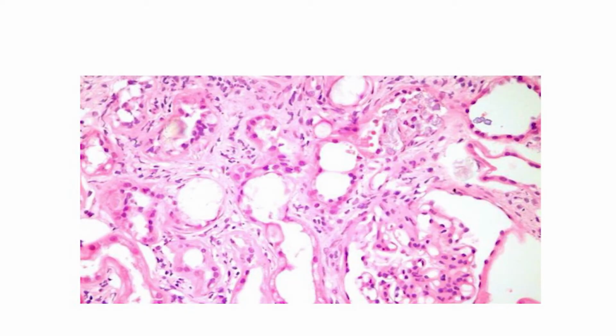In terms of tubulointerstitial pathology, this is probably the commonest I see in my Oxford practice. So, typical history: diabetic, acute deterioration in renal function. Any ideas of the diagnosis looking at that? We've got some funny looking tubules, haven't we, with rather flattened epithelium.